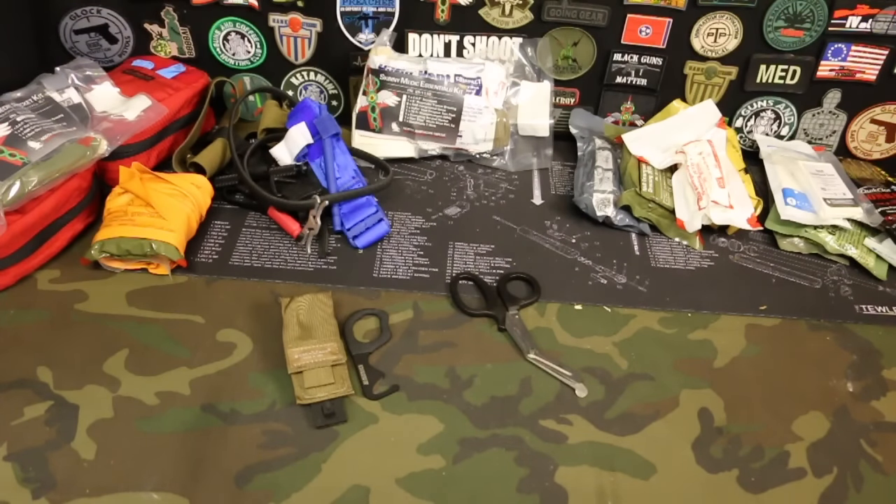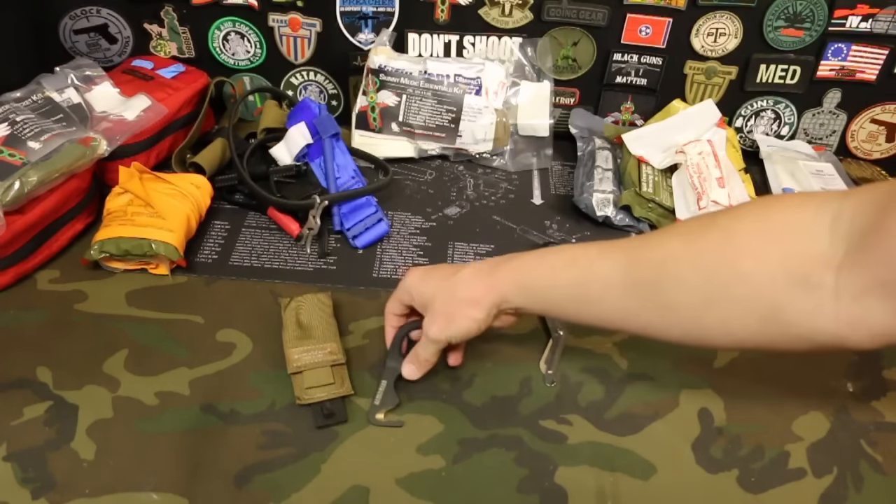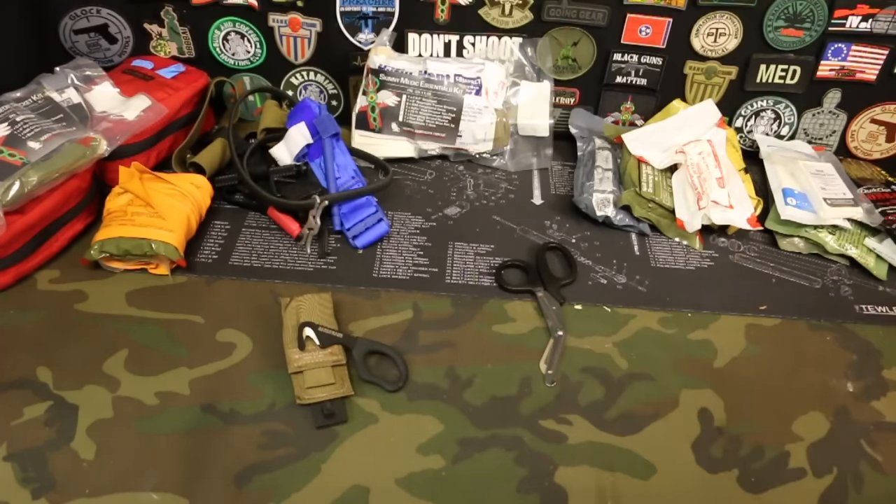One of the things that people often leave out of their trauma kits is shears or scissors — some way of getting the clothes off the patient. Because if you can't see the trauma, you can't fix it. You have to be able to expose your patient. Using a regular pocket knife could be dangerous and could end up causing more injuries. So I keep a pair of EMT shears, and I've also got the Benchmade hook that works really well. Some way of exposing the patient — pulling the shirt, cutting the shirt, cutting their pants — things like that.